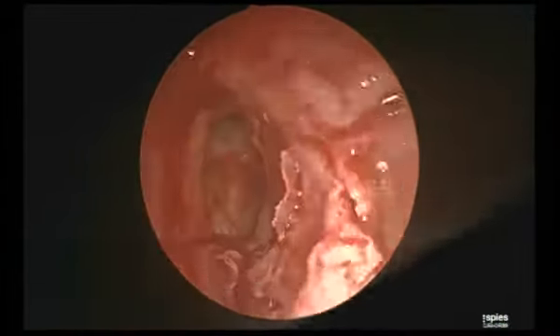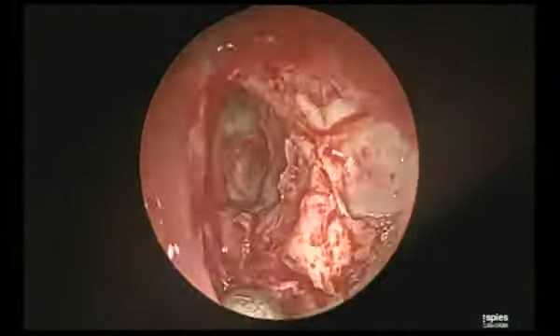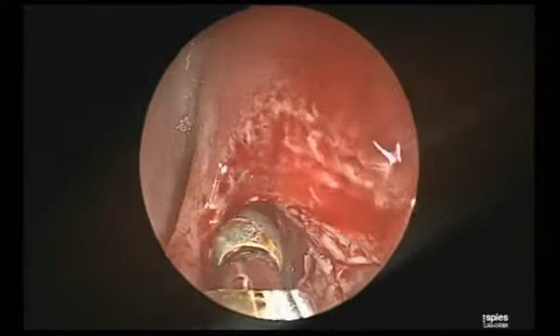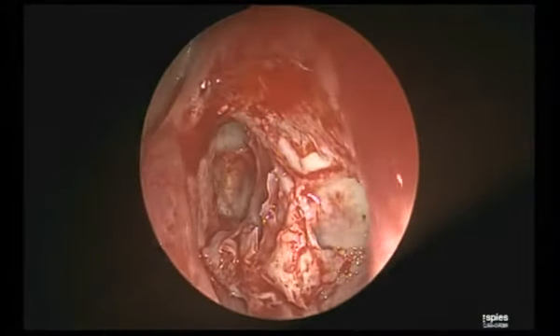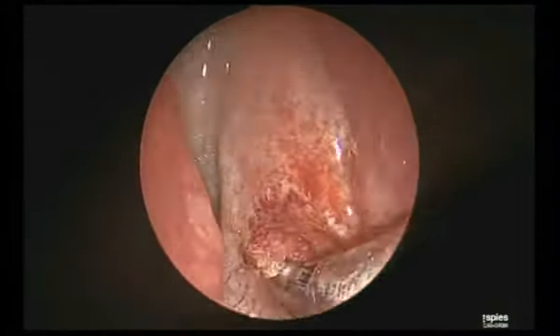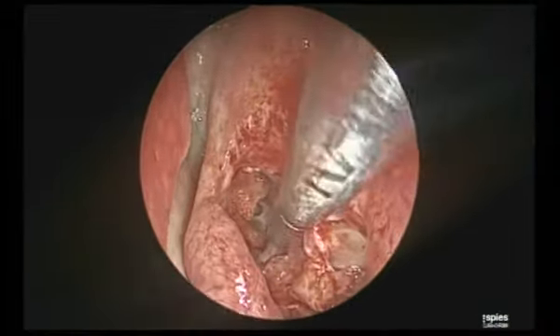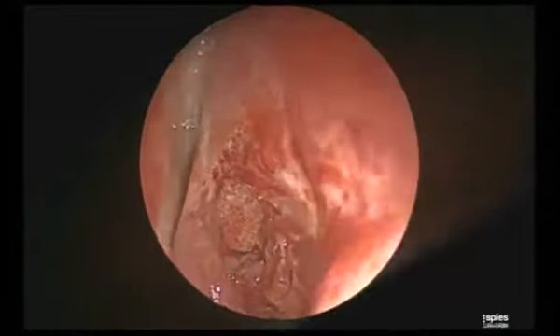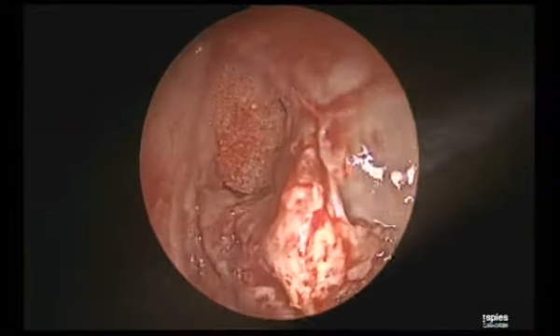Now, of course, you are very versatile in using a 70-degree scope. There are a few people who do struggle to use this. What is your comment on Wormald's axillary flap and using a 0-degree? See, that technique was developed by the people earlier who were not good with 70 degree. One cannot replace it with 70 degree. The science is evolving, boss. If something works better, you have to accept it.